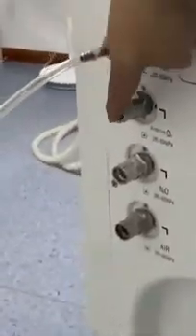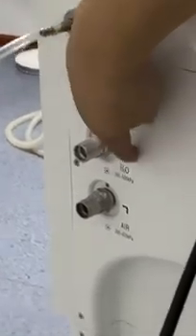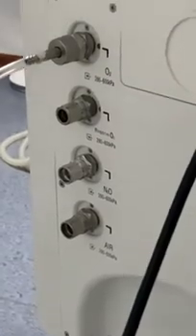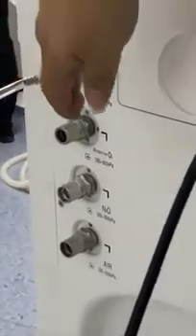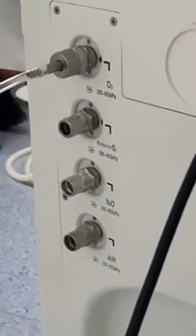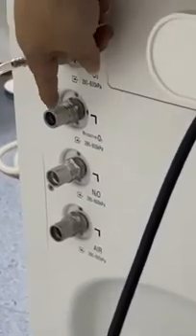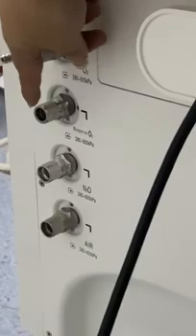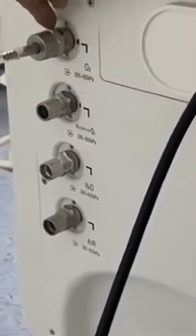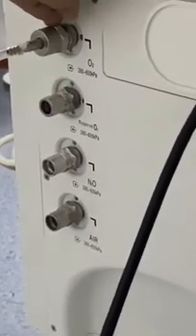And here we have 4 gas sockets, and the first ones you can see we have 2 for oxygen, 1 for nitrous oxide and 1 for air, because oxygen is the driving gas for this machine, so we have 2 oxygen. So how can we use it? For example, if you have both the central oxygen supply and the oxygen cylinder, then we can connect the central oxygen supply to the first one, and the second one connect to the oxygen cylinder. So once it detects the central gas supply has a problem, the cylinder will give the gas. Once the cylinder has a problem, the other one will also automatically switch. So it will ensure the machine always has oxygen and can always be used properly.